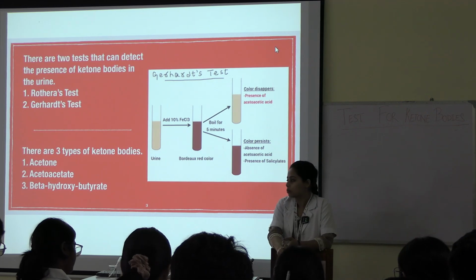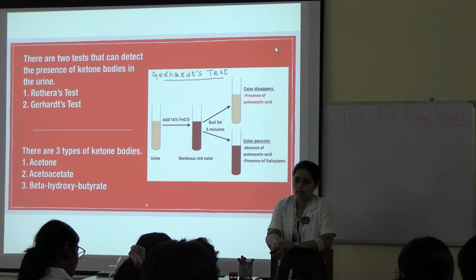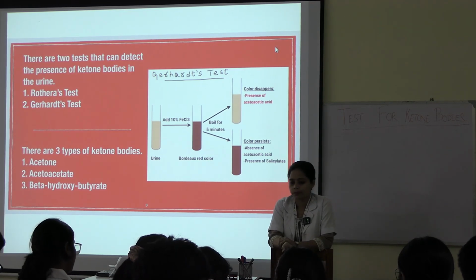Ma'am, the urine sample will take 3 to 5 minutes. Huh? Urine sample? Yes, 3 to 5.